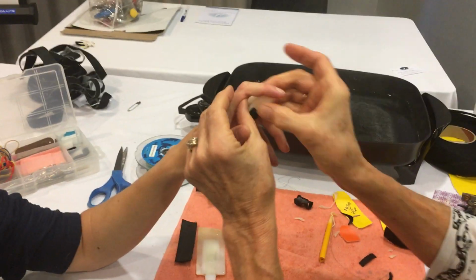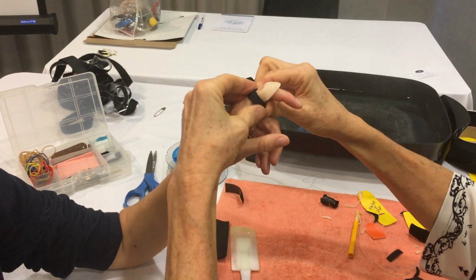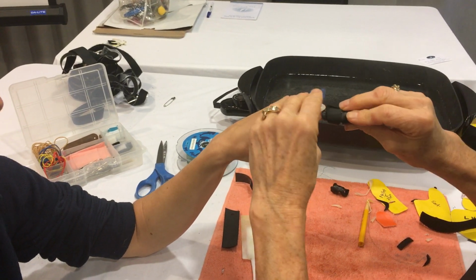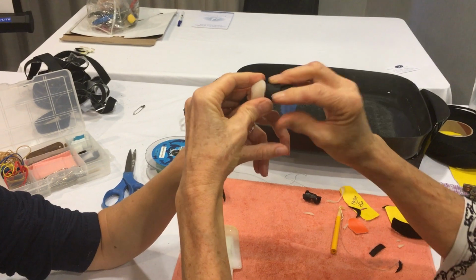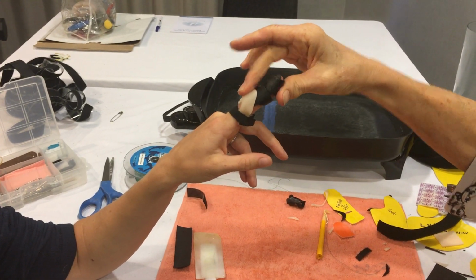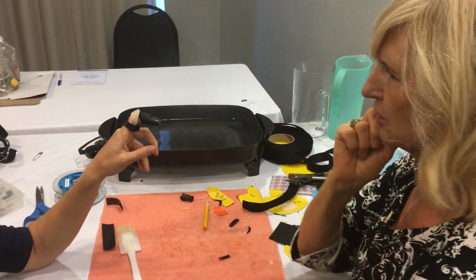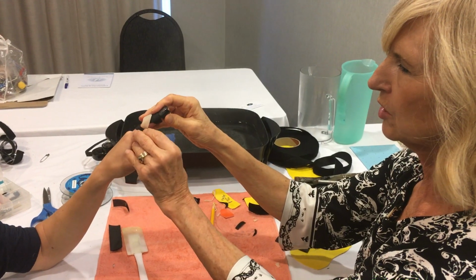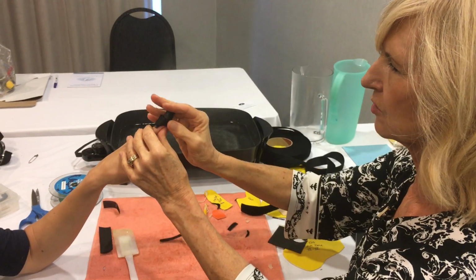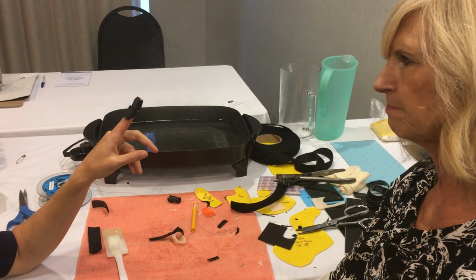So I'm going to put this on. Push the finger through. This goes on here. Okay, so that stays there. And then this one goes there. So that's holding the DIP in hyperextension. It's allowing extension to a limited range, so that's going to prevent hyperextension deformity, and it's allowing for flexion. Okay, at 3 weeks, when you no longer need to include the PIP joint, of course, this comes off, and this goes back on for the remainder of the immobilization period, which is another 3 to 5 weeks.